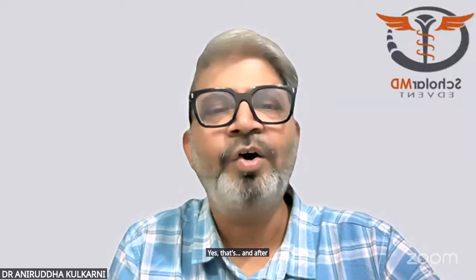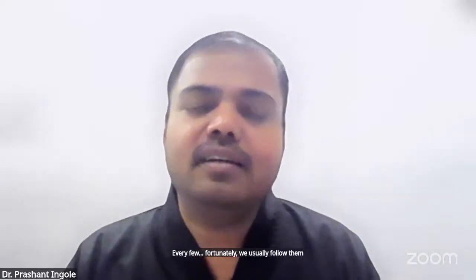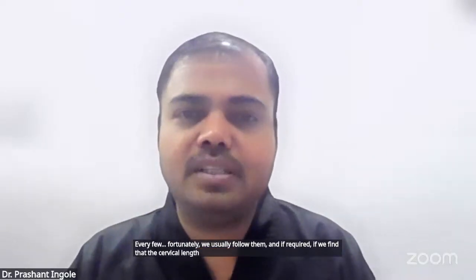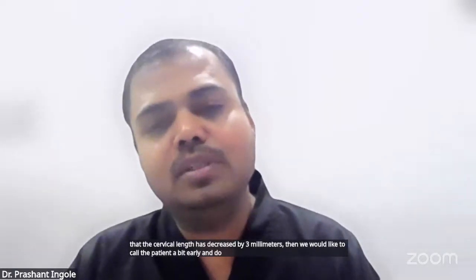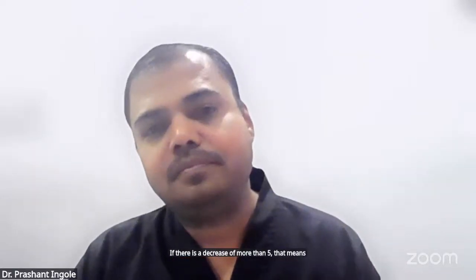After encerclage, at what interval do we need to follow the cervical length, Dr. Prashant? Every fortnight, we usually follow them. And if we find that the cervical length has decreased by 3 millimeters, then we would like to call the patient a bit early and do the surveillance again. If there is a decrease of more than 5, that means it is significant.